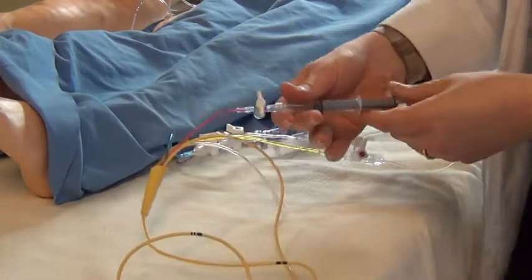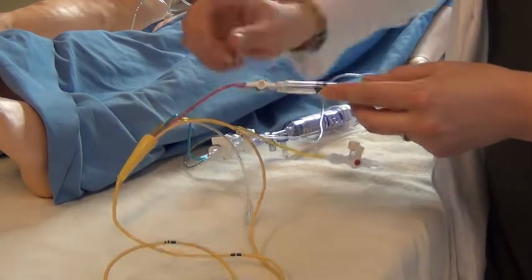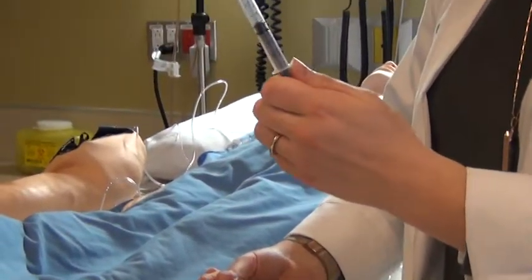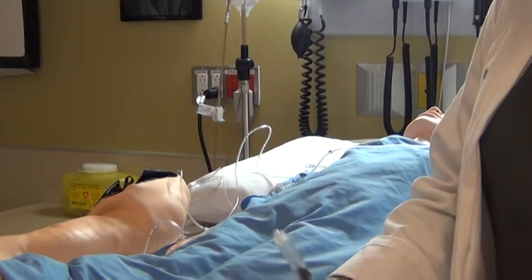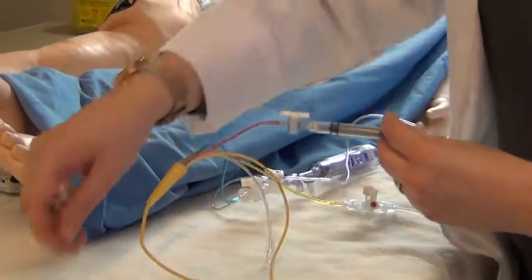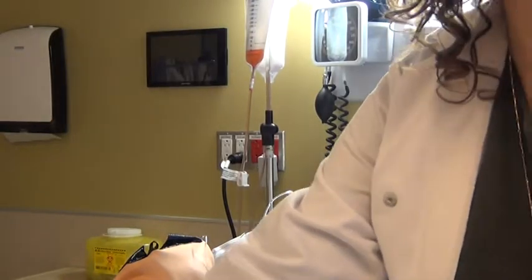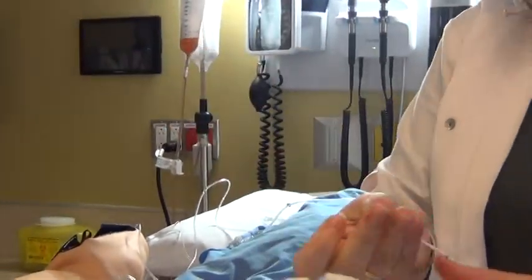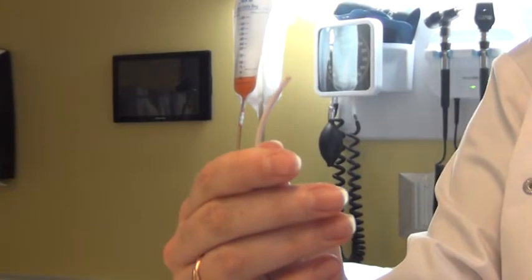The next line has a syringe connected to it — a special 3 mL syringe. When the line is straight it is open. This syringe has a maximum of 1.5 mL of air and comes pre-set with the pulmonary artery catheter kit. As air is pushed into this syringe, the balloon at the tip of the pulmonary artery catheter inflates — I'll demonstrate on a catheter with a functioning balloon.